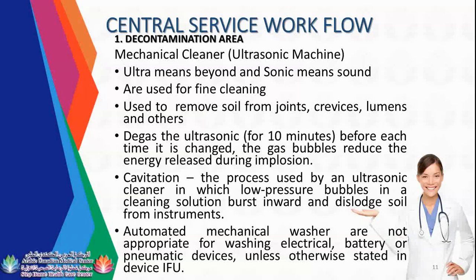Automated mechanical washers are not appropriate for washing electrical, battery or pneumatic devices unless otherwise stated in the device IFU. This machine, guys, since you need to soak the instruments in this tank, any battery-operated instruments are not allowed to be soaked here because it will cause damage to the instruments. It states unless otherwise stated in the device IFU. IFU means instructions for use. So even though it is battery operated, if your IFU states that it can be soaked in an ultrasonic machine, then the IFU will be followed.